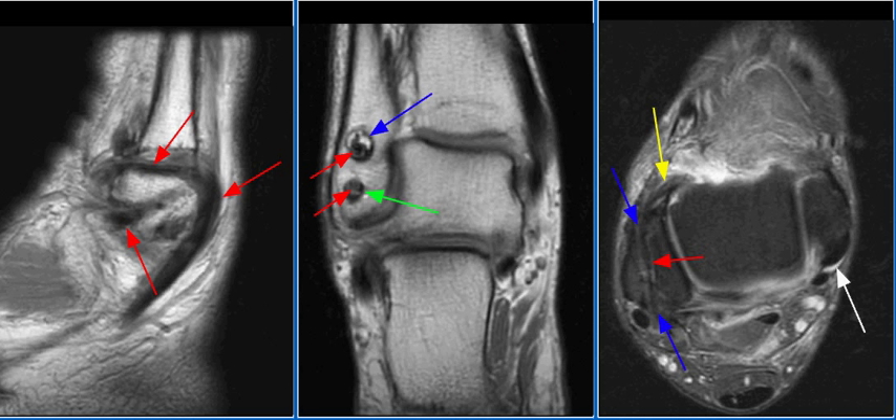The Watson-Jones procedure, demonstrated in this case, involves rerouting of the peroneus brevis through fibular and talar tunnels. It sacrifices the entire peroneus brevis tendon and does not reconstruct the calcaneofibular ligament.